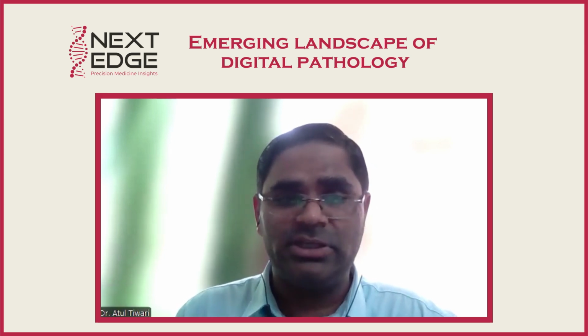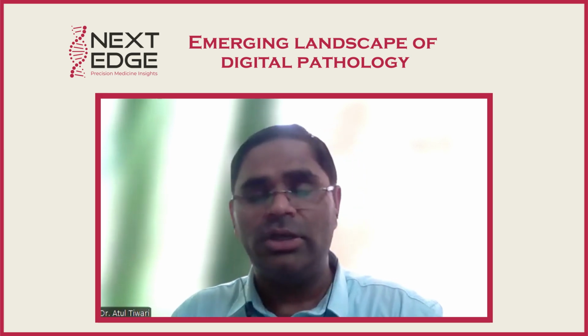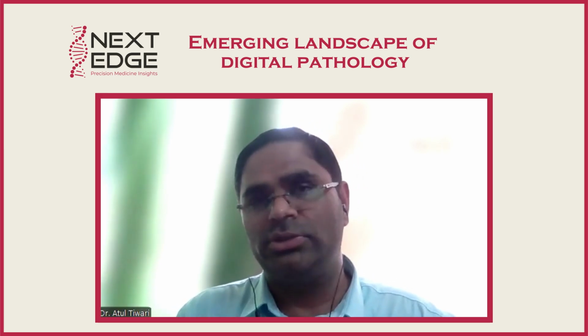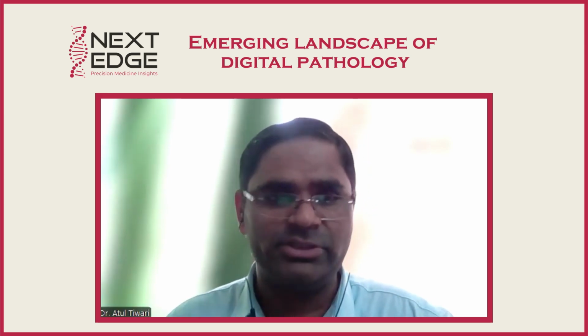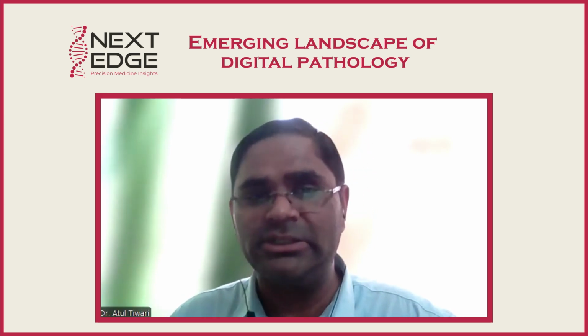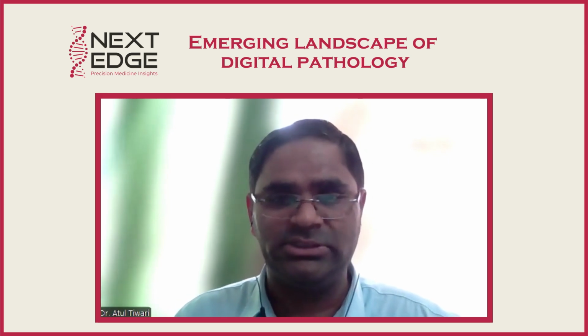So if we have a digital pathology system, we can store slides for a longer period of time. Nowadays, cloud storage has become quite affordable as compared to 5 years ago. Many competitors are there, and that has lowered the prices. So it is easy to manage the slides on the cloud.